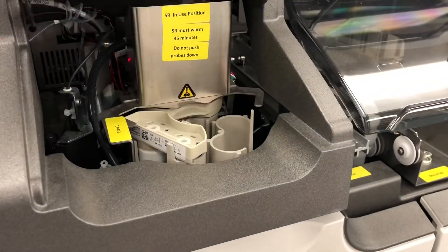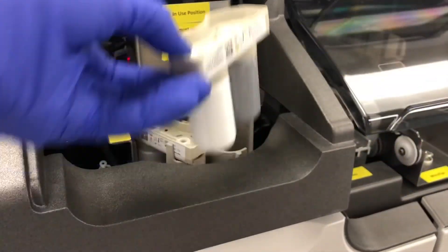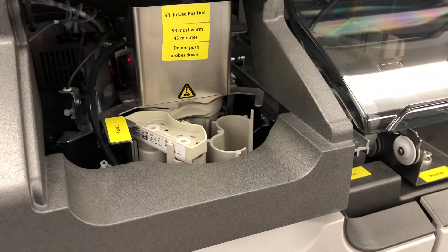Finally, we come to the signal reagent, which is located just to the left of the sample loading area. For this one, you just take it out of the refrigerator and pop it in the holder. That's it.